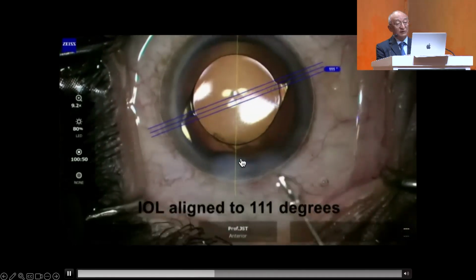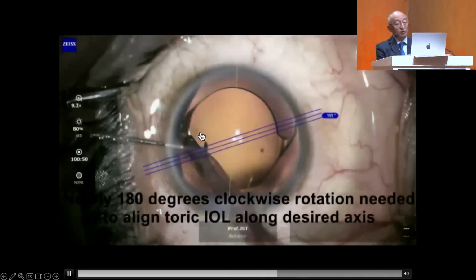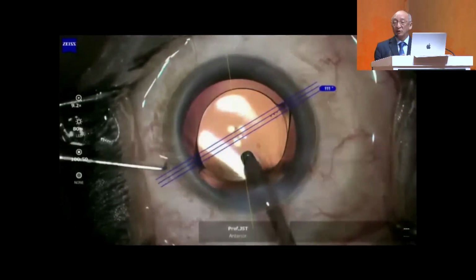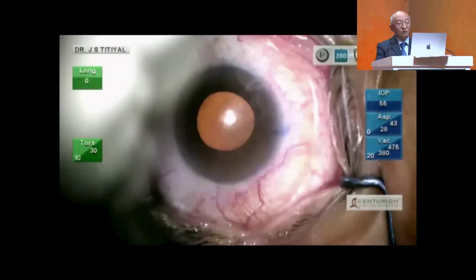By this time, with the hydration, the lens would shift. So this is a shift, clockwise. So this lens cannot be rotated anti-clockwise. So that's why there's always a tip: keep your lens a little anti-clockwise when you are doing the hydration manipulation, so that you can shift the lens clockwise, which is easier also. Manual marking should be very sharp.